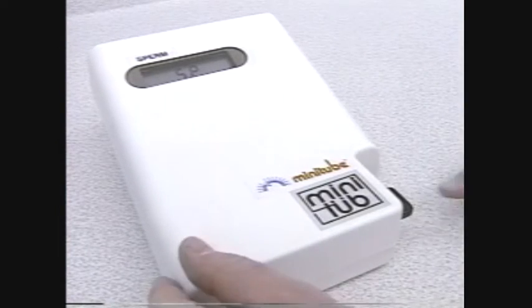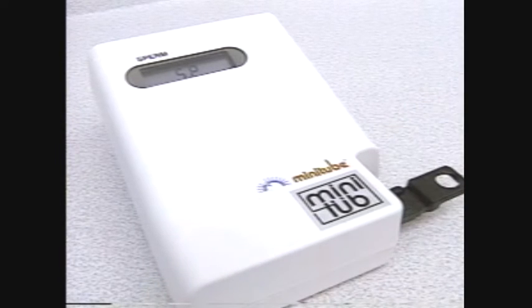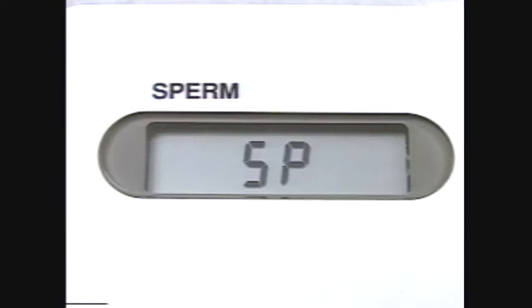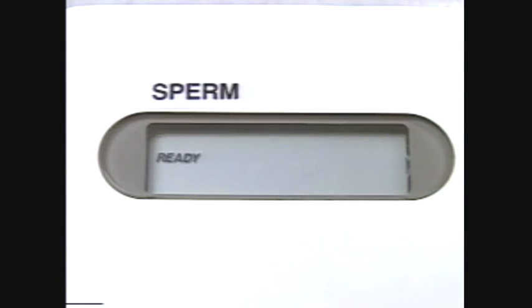First, turn the unit on and pull the black slide out of the lower right-hand corner until it clicks, with the chamber for the cuvette fully exposed. The SpermaQ will reset itself to 0 each time the slide is pulled out to this position, and then in a few seconds, the display will read ready.